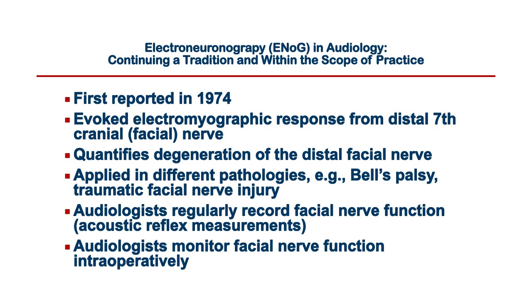So to make a long story short, I started to become competent in recording ENoG. I practiced on myself and on my kids and audiologists in the clinic, and I found that it wasn't that difficult to record, although as you'll learn later in this lecture, the analysis can sometimes be challenging. And a lot of important decisions are based on ENoG results. So you don't want to make a mistake.